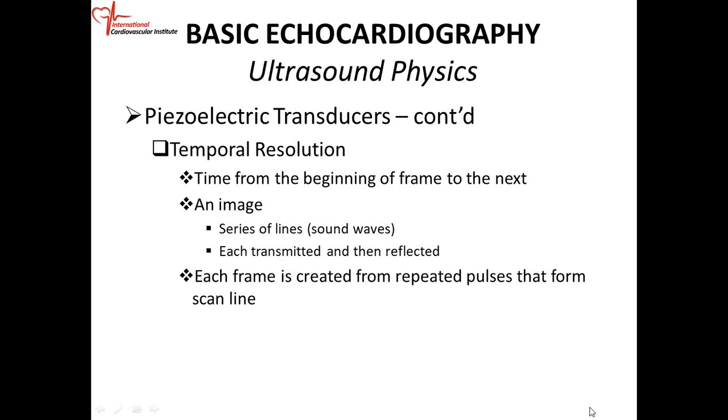What we looked at before was spatial resolution. And when we talk about spatial resolution, as we pointed out before, it is the ability to locate two points as two separate points, and they can be either axial resolution or lateral resolution.